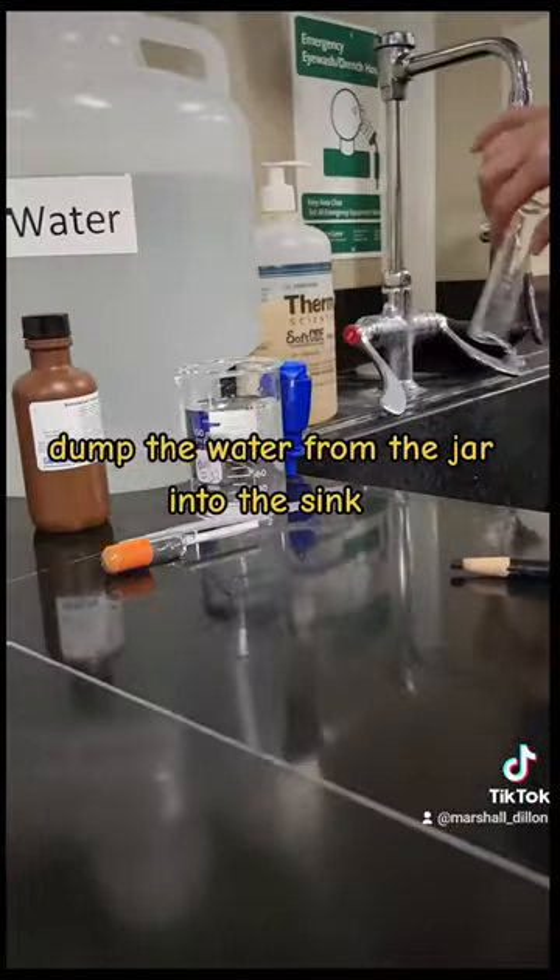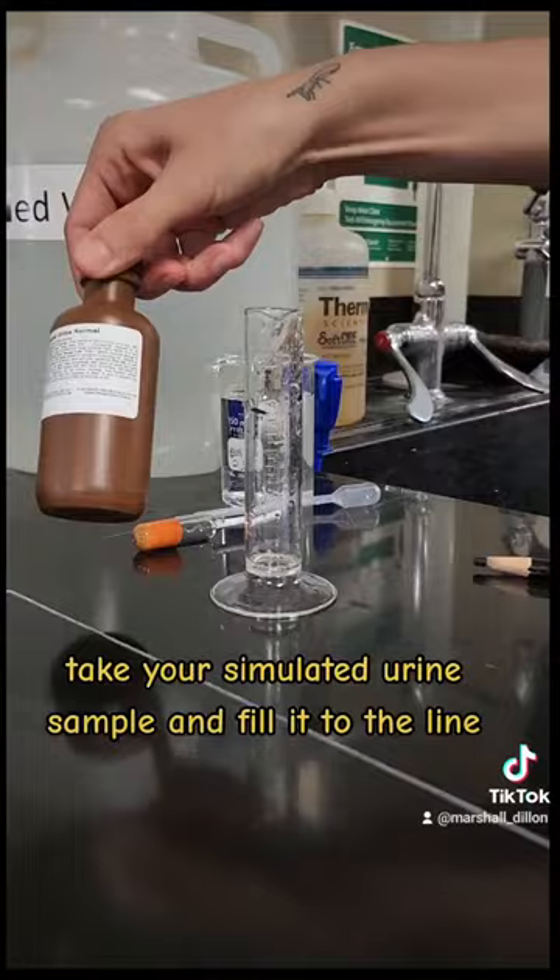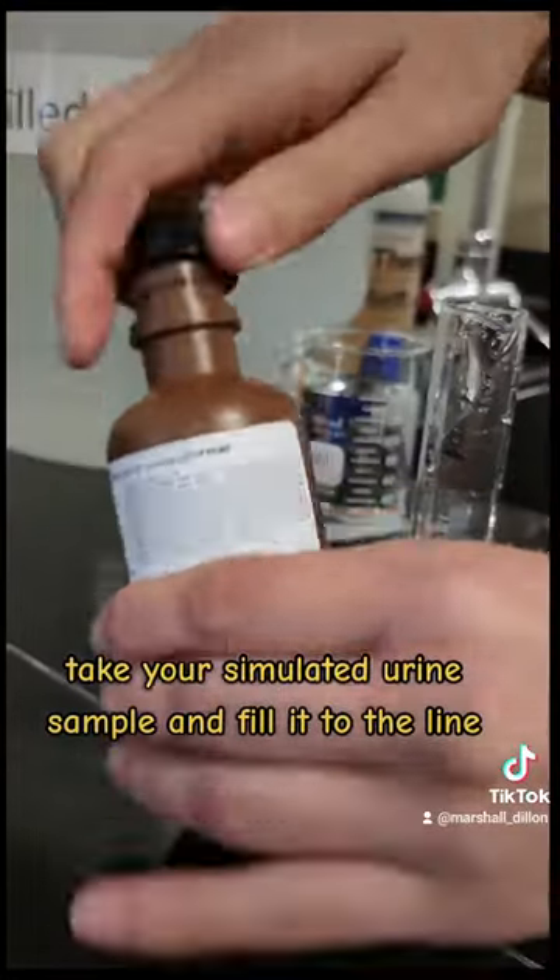Dump the water from the jar into the sink. Take your simulated urine sample and fill it to the line.